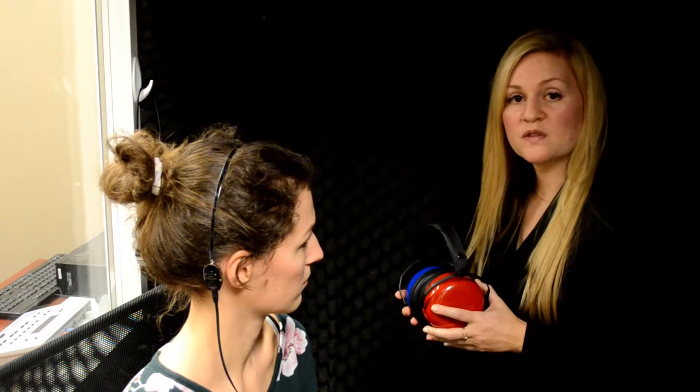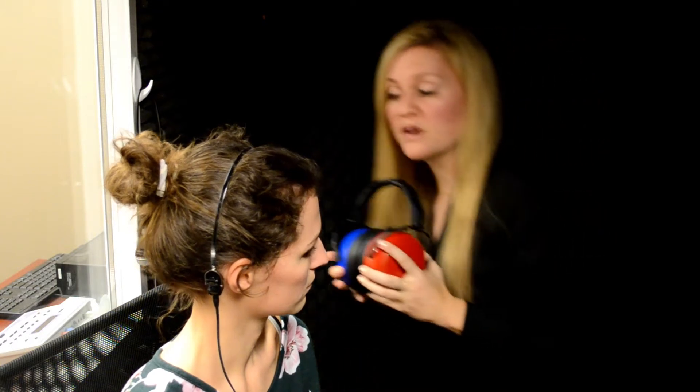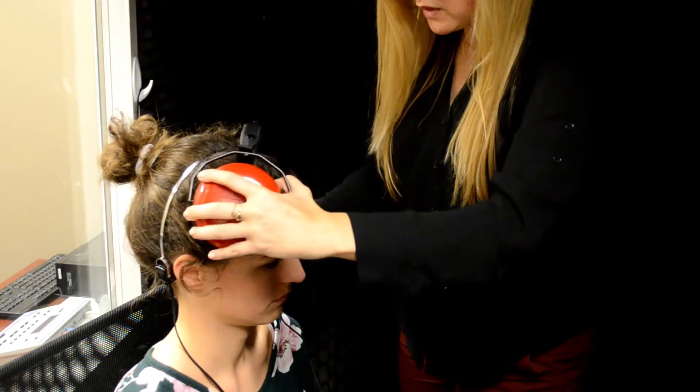Now we're going to show you how to place your audio cups for masking for bone conduction testing. We have the bone oscillator on the right side, so we're going to put the left audio cup on the left ear, and then we also want to make sure that the right audio cup hasn't moved our bone oscillator.